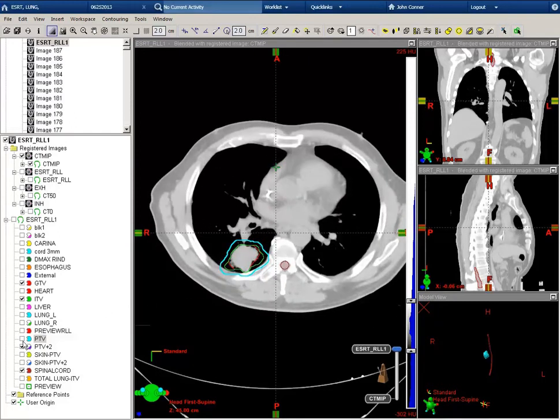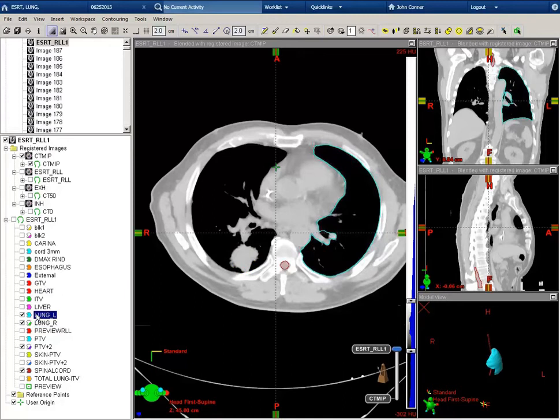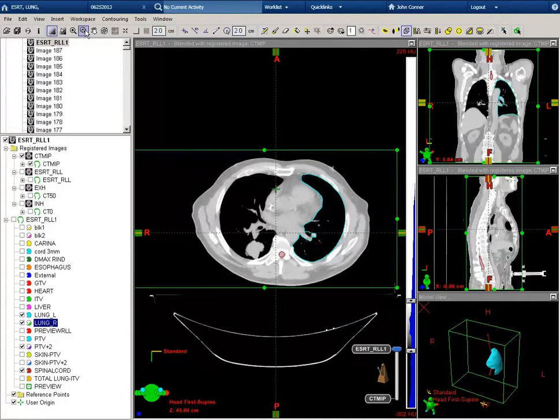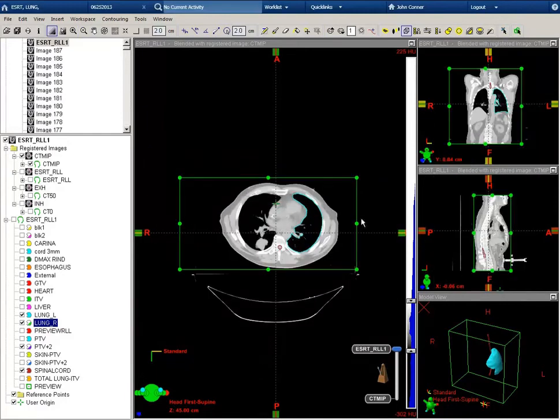Next, I'll show you how to contour one of the lungs. The left lung is here in blue, and that's already contoured for us. I'm going to show you how to contour the right lung, so I'll turn the VOI bounding box on.